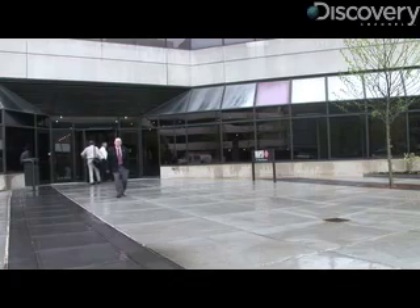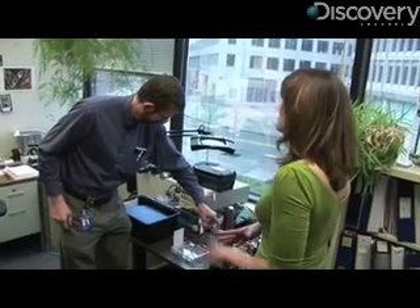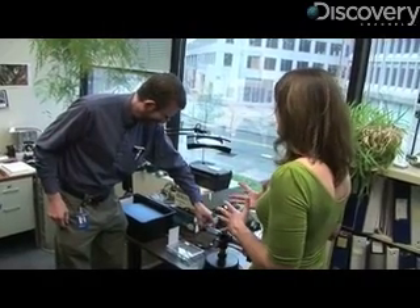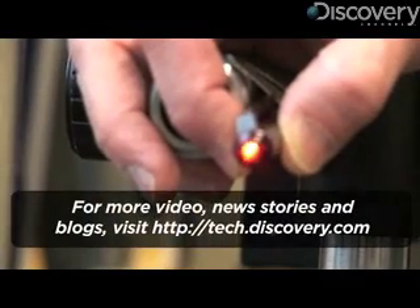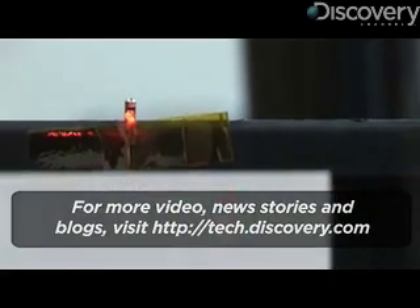Draper Labs and Mass General Hospital are working together to build the entire endoscope, and Mass General is where Bernstein is testing his new software. He says his team is already getting great results with the MEMS mirrors. For Discovery News, I'm KC D Gardner.